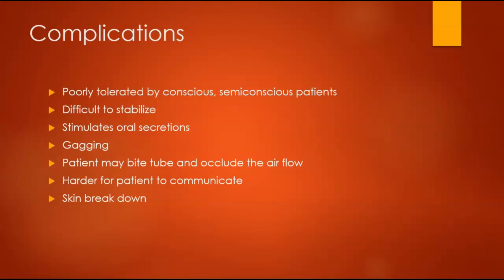ET tubes can sometimes be difficult to stabilize, meaning secure. With intubation, a lot of times patients have excessive amounts of oral secretions, which isn't good. They get really, really drooly. So you'll see a lot of ICU patients getting treated with scopolamine patches. It's a little medicated patch we put behind their ears to help dry up some of those oral secretions.